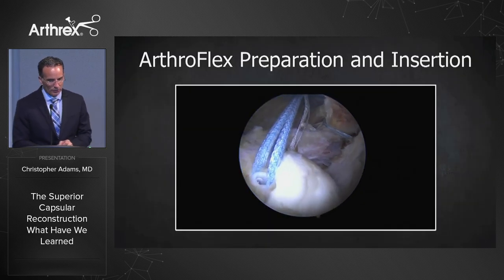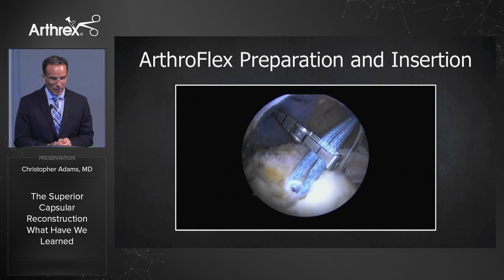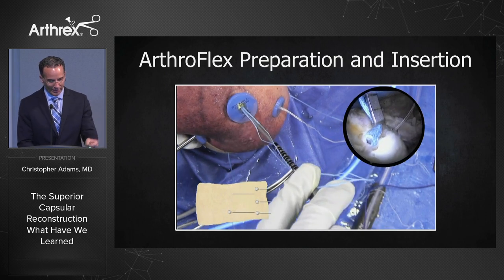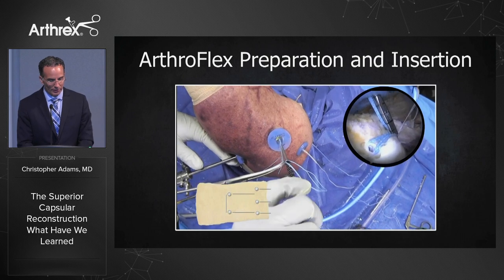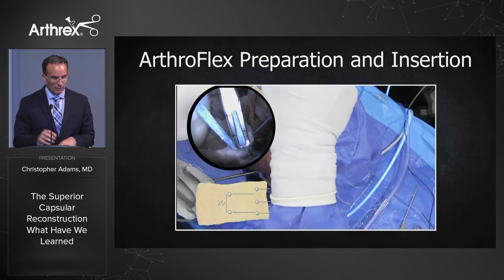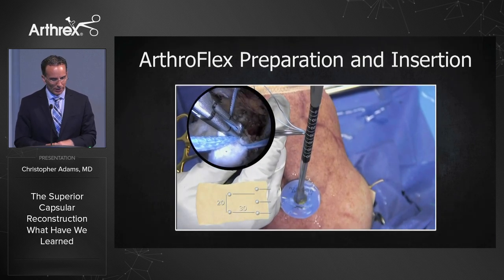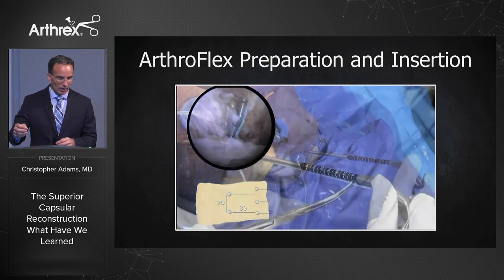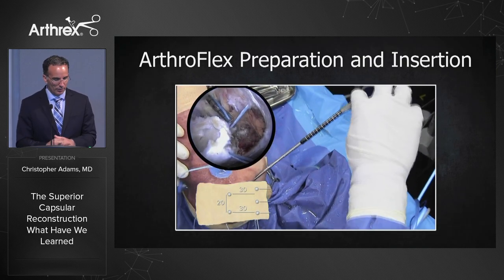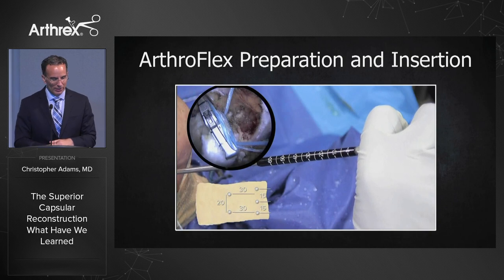Back to the cadaveric demonstration. Using the SCR measuring device makes it very convenient for measuring distances between anchors. Get the proper arm position, calibrate it to zero, then bring it over to that anterior anchor on the greater tuberosity — you can go across an arc with this device. We measured 20 millimeters in this case, marked it on the back table. Then going to the posterior superior anchor on the glenoid, it's 30 millimeters in this case. Next, the anterior superior anchor: calibrate back to zero, go over to the greater tuberosity — 30 millimeters again — then across the arc of the glenoid, measuring 15 millimeters between each of the anchors on the glenoid side.